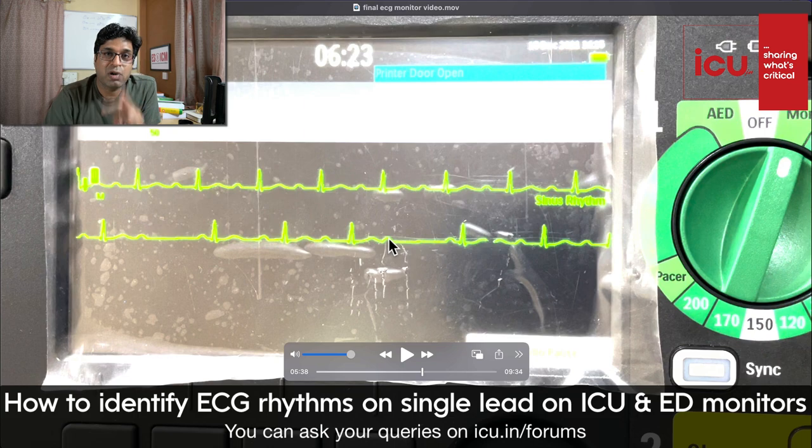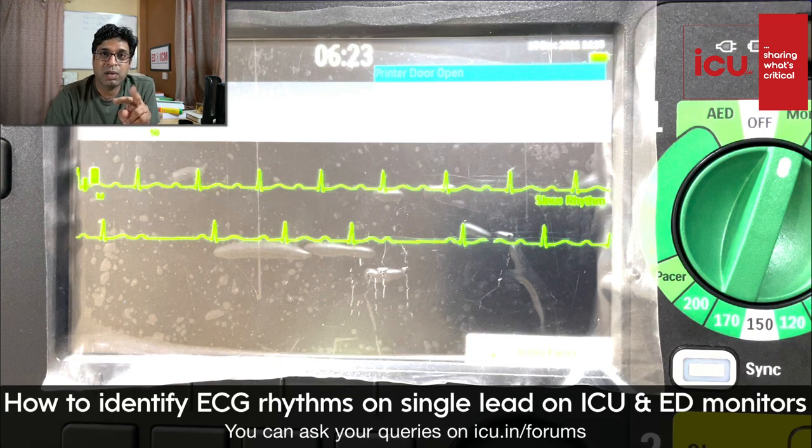In Mobitz type 2, what happens? You hire a new employee, he comes at 9 o'clock, and suddenly on the 4th day, he doesn't come. Or he comes 2 times and on the 3rd day, he doesn't come. You cannot predict when this fellow will come to the ICU or not. So it is unpredictable, and then it creates a mess. So Mobitz type 2 block needs to be taken care of, a pacemaker is required, that's why.